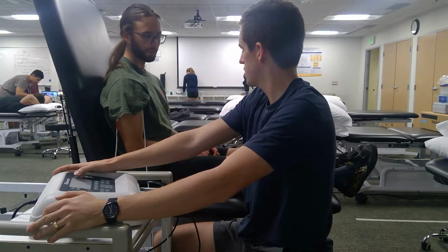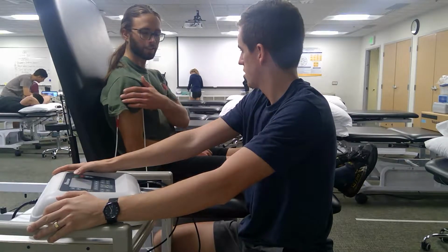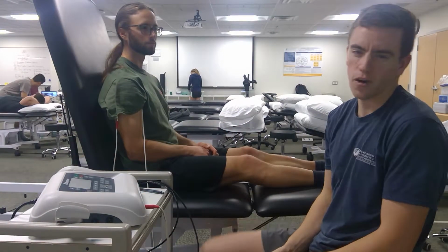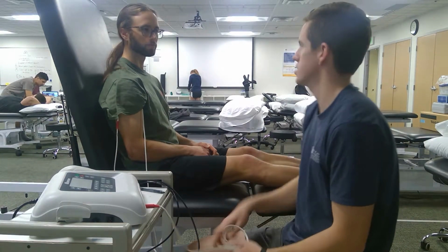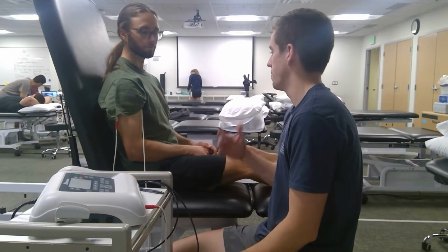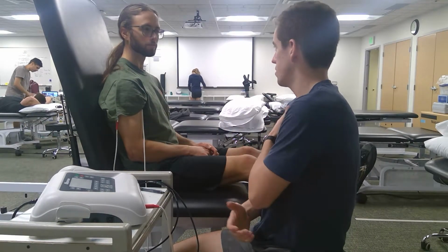Any tingling sensation? Very, very faintly. It's at 200. Is that comfortable right there? Yeah. Okay. That's good. So then we would sit here and we'd let that run for about 20 minutes. We're going to continue to check with the patient to make sure things are comfortable. We're going to let this run just for a couple seconds. We're not going to do the whole 20 minutes. That'd be a long video for you to watch, Dr. Clausen. So again, the sensation there is just going to be light tingling. We shouldn't have any muscle contractions.